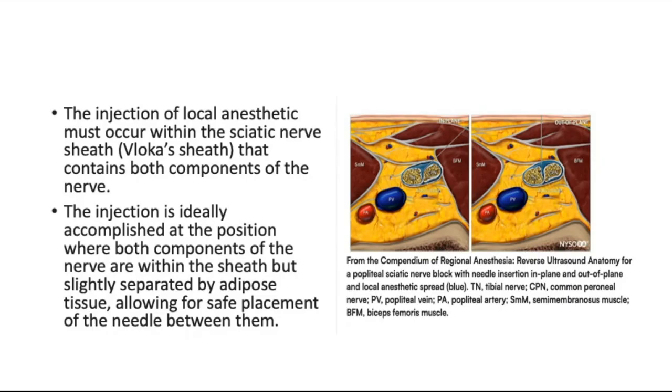Okay, question from online. Hi doctor, is it recommended to use nerve monitoring to identify the sciatic nerve for the anterior approach? If so, how is the placement of the electrode like? Another question, if the LA is deposited prior to the split of the sciatic nerve for popliteal sciatic nerve block, will the CPN be blocked as well?